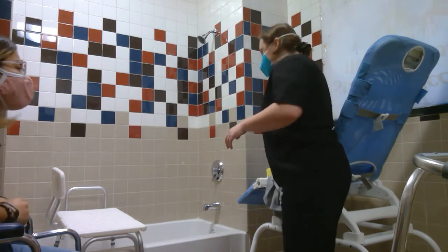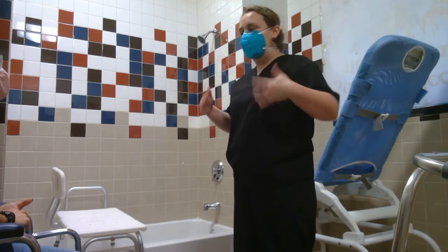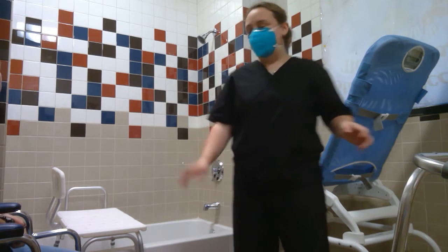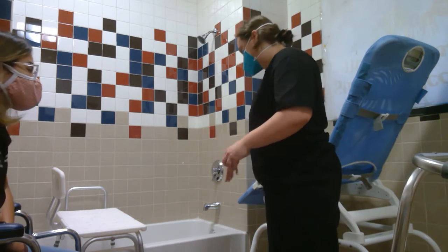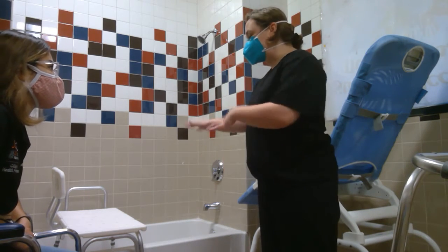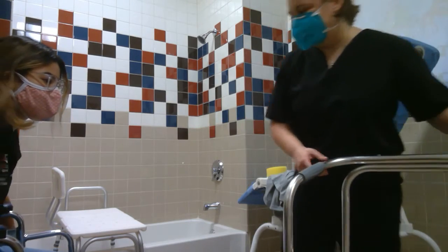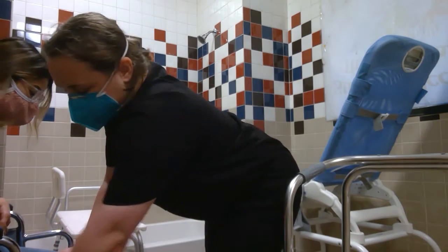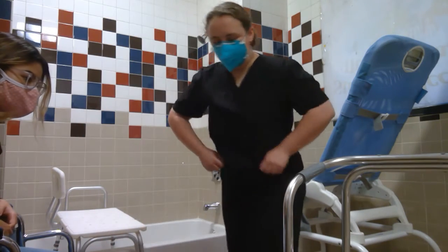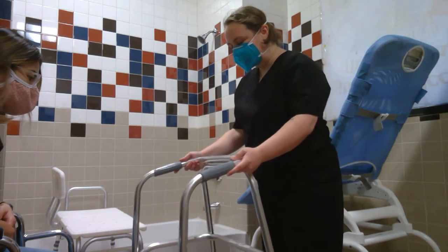All right. So, like we did over here when we got out of the chair to stand and also going to sit back down, we're going to go into this tub right here. Once you sit down, I'll give you a couple more instructions because we need to get over that tub. But first, I want you to get you sitting on the tub, all right? Okay. All right, so let me go ahead and lock your brakes. Always remember to lock your brakes whenever you're moving around, whenever you have to get out of the wheelchair.